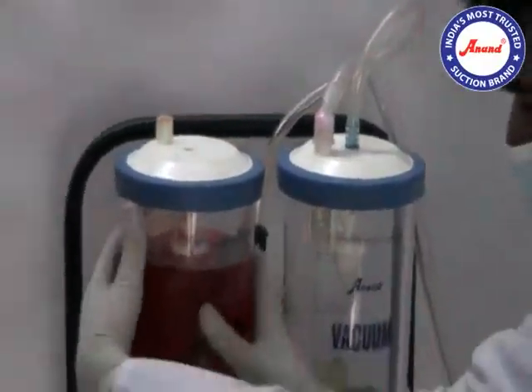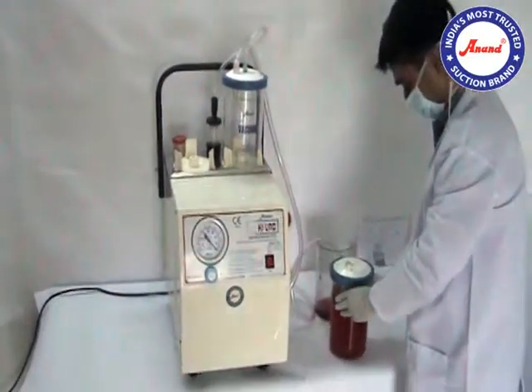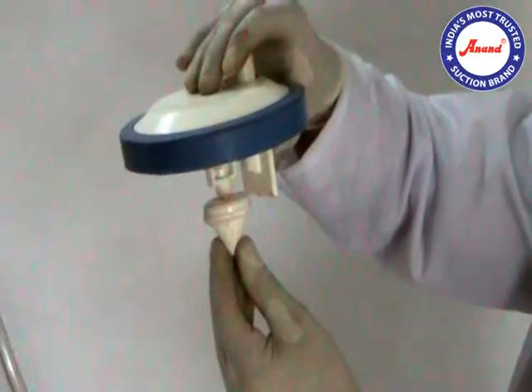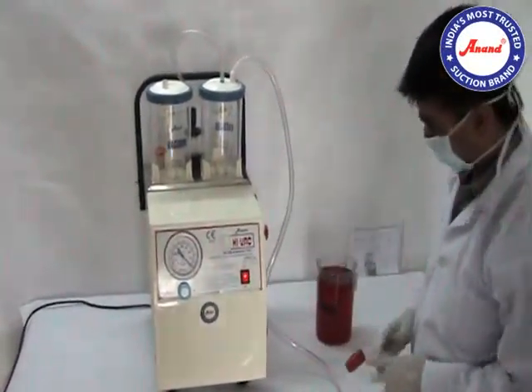Clean the used jar. Let the mechanical overflow cutoff device run thoroughly under running water. This is the mechanical overflow cutoff device. The second jar is ready for use.